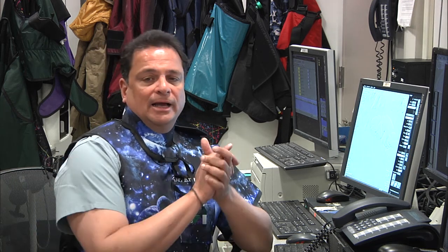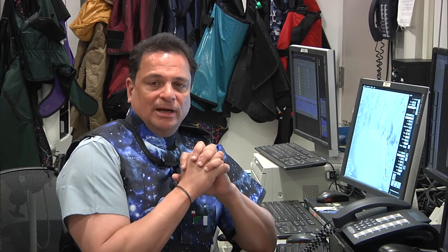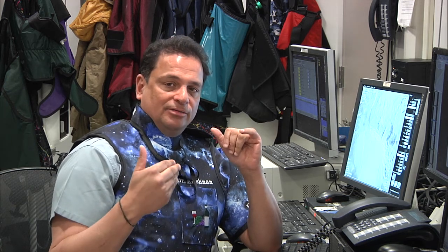Good morning, everybody. I'm here to present the completion of the case done on March the 8th. You remember it was a patient who had critical limb ischemia, who failed 2 bypass grafts. We had done a very complex superficial femoral artery intervention, and we had brought him back for the stage of the peroneal artery with retrograde and antegrade access.